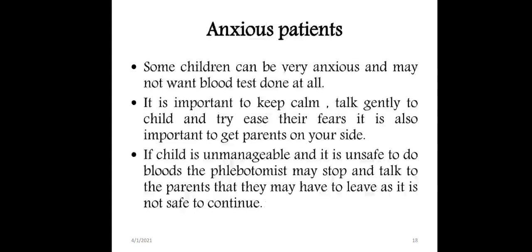Anxious patient. Some children can be very anxious and may not want blood tests done at all. It is important to keep calm, talk gently to the child and try to ease their fear. It is also important to get the parent on your side. If the child is unmanageable and it is unsafe to draw blood, the phlebotomist may stop and talk to the parents, saying that they may have to leave as it is not safe to continue.